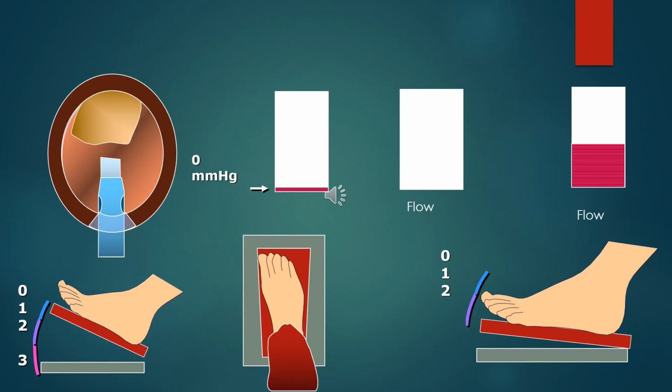you have got a good hold of the nucleus piece. Why do you need that vacuum? Because you need to have a good hold of the nucleus piece. And why do you need to have a good hold of the nucleus piece? Because you will now hit the nucleus piece with power as you go to foot position 3. As you go to foot position 3, you get power. So the nucleus piece now will be hit and it will break.